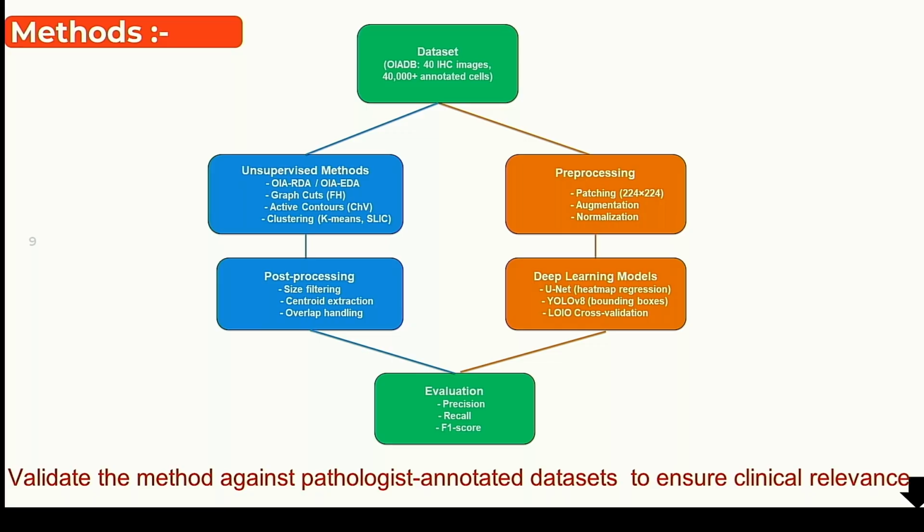But in this presentation, I will concentrate on the supervised segmentation method, because we already published a paper in 2024 using the unsupervised method, which has 6 algorithms. We counted and classified and at the end evaluated the number of cells and counting those cells. In this presentation, I will show it again, but using a new perspective, which is supervised learning.